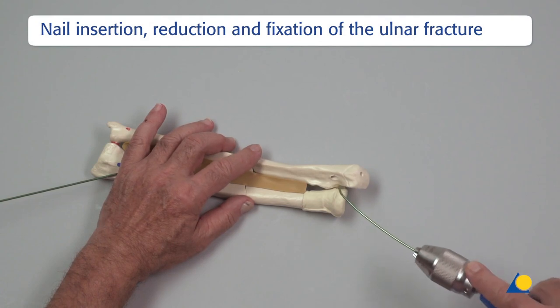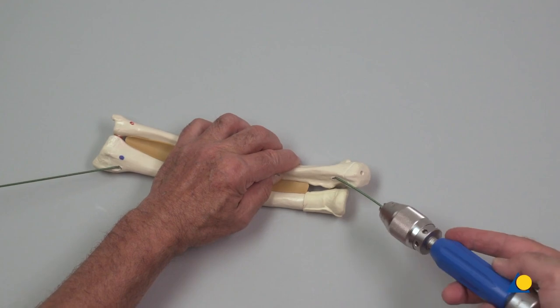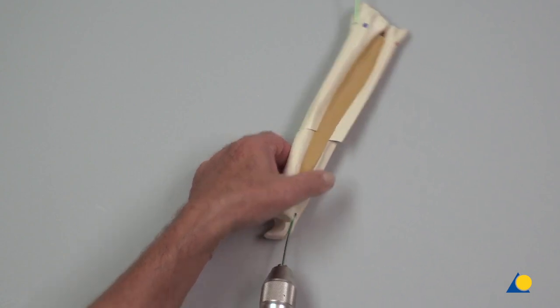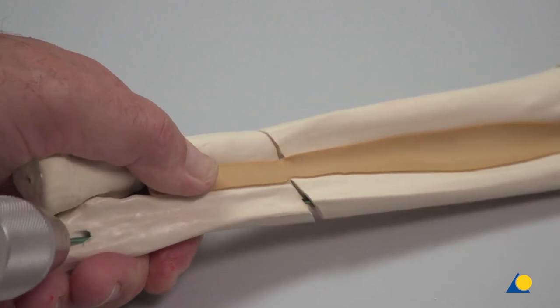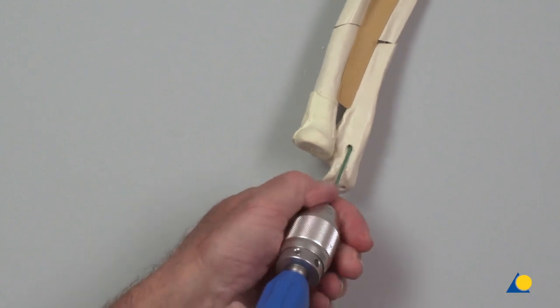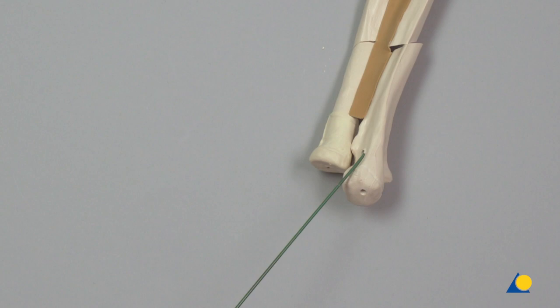The ulna nail is manually inserted, rotated through 180 degrees, and advanced up to the fracture site using the inserter for TEN, then advanced across the fracture line into the distal metaphysis. The fracture is fixed and the inserter is removed. The use of a hammer is not recommended, since hammering may produce further fracture fragmentation or perforation of the cortex.